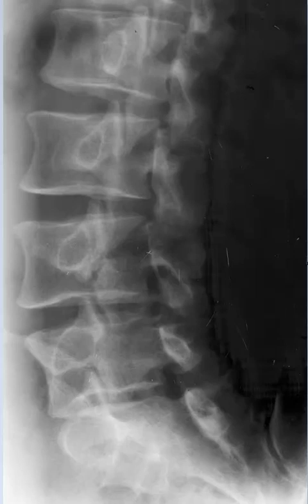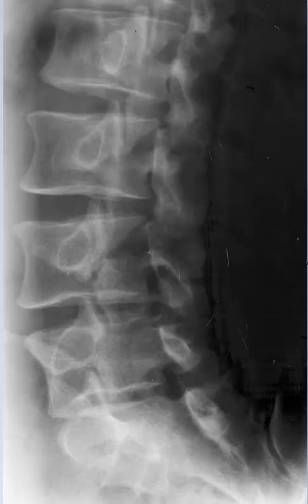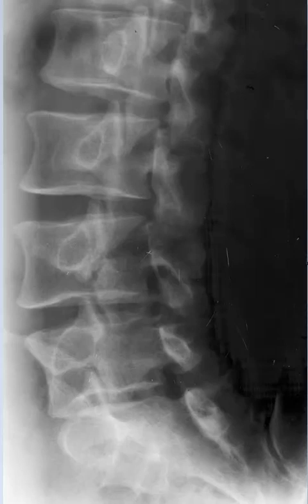Oblique projections should be taken either AP or PA, meaning that you're going to take either anterior obliques or posterior obliques on the right and left side.